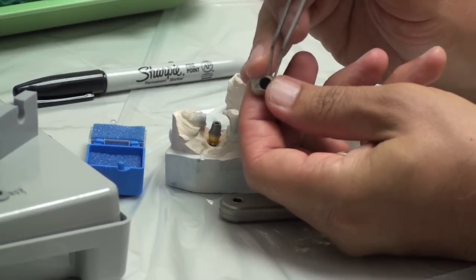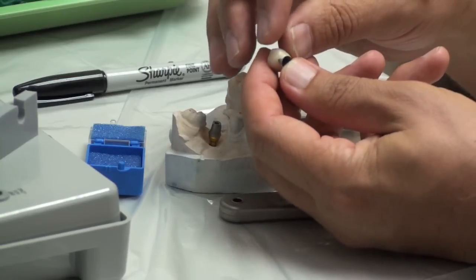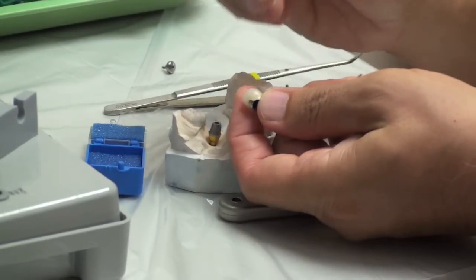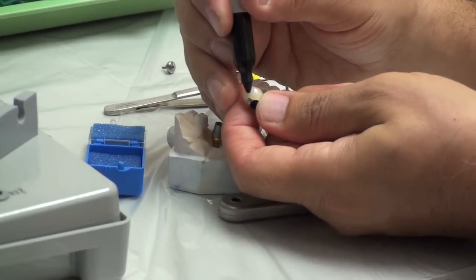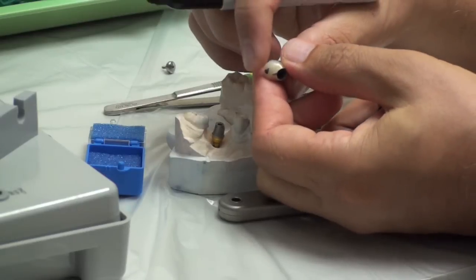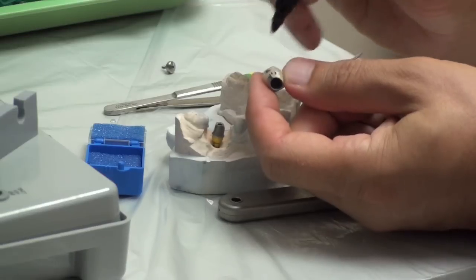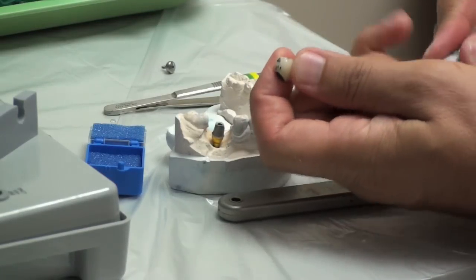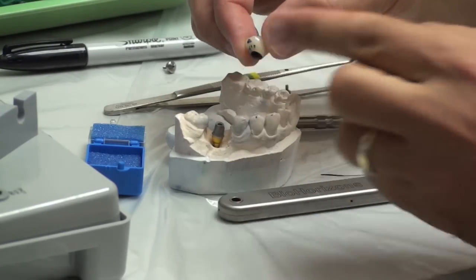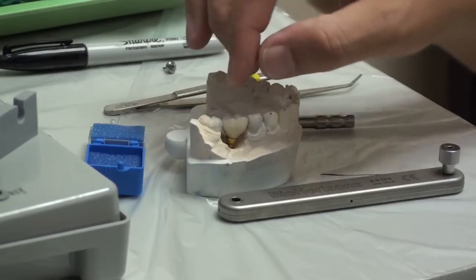We're not talking about the interior surface - we're talking about adjusting over here on the porcelain, in the area below the contact. Here's the contact - we're not going to adjust that. We're not going to adjust the margins of the crown. But it's this area here where there could be some tissue contact. Take your greenstone and hollow grind that out - take your greenstone to duplicate the shape of the tissue until you get it so that it's comfortable.